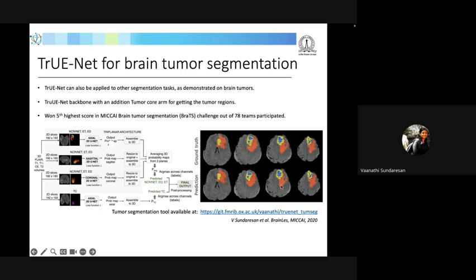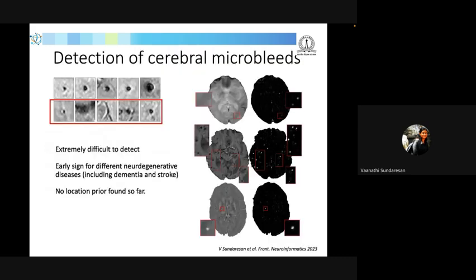So we are able to get a very good method, and this method also showed better performance than the state-of-the-art method again. This tool was very useful in detecting various localized lesions. And now this is another example, where I will also be talking about certain lightweight models.